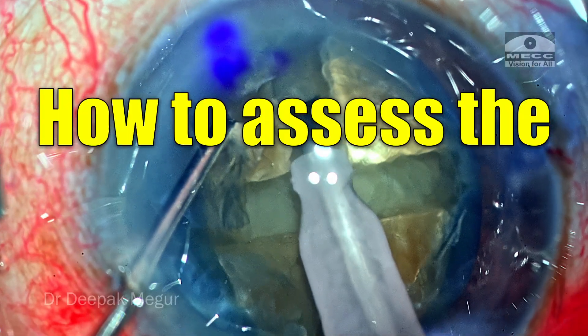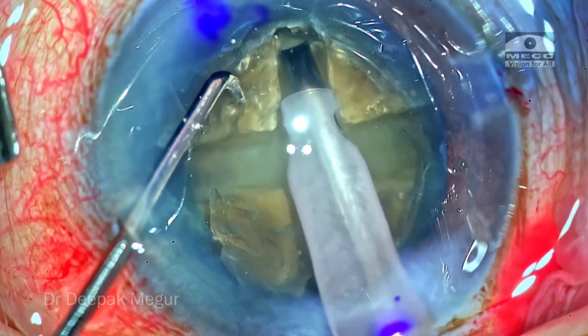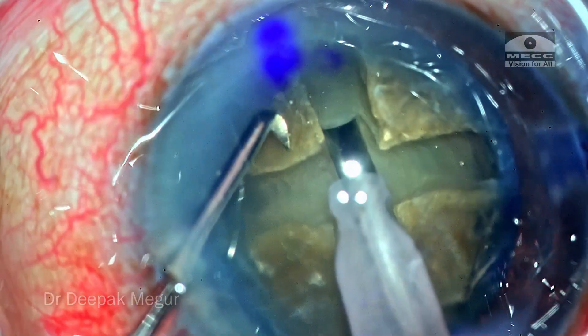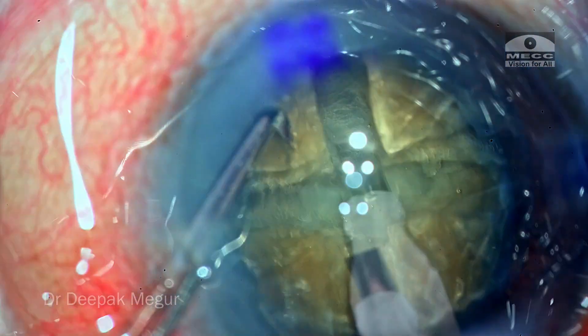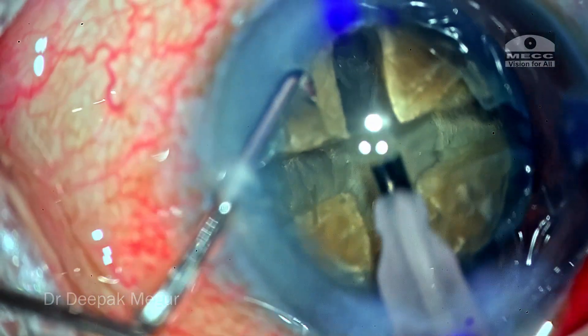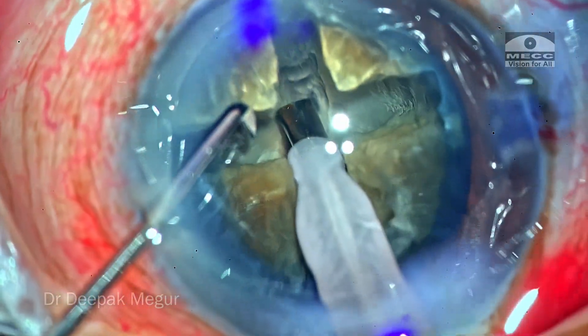How do we assess the depth of the groove when we make sculpting? Are we too deep? Are we too superficial? Let's delve into this topic as I demonstrate the classical divide-and-conquer four-quadrant technique, where I'll be sculpting and creating four grooves in this slightly denser cataract.